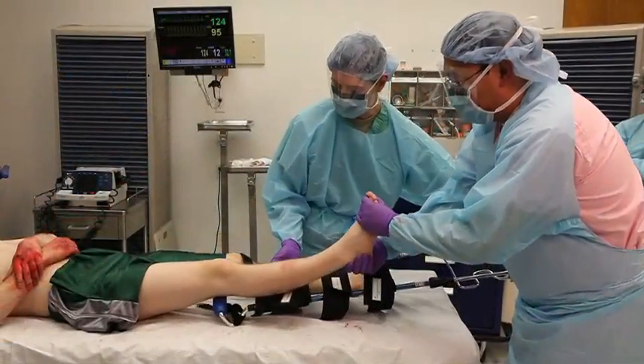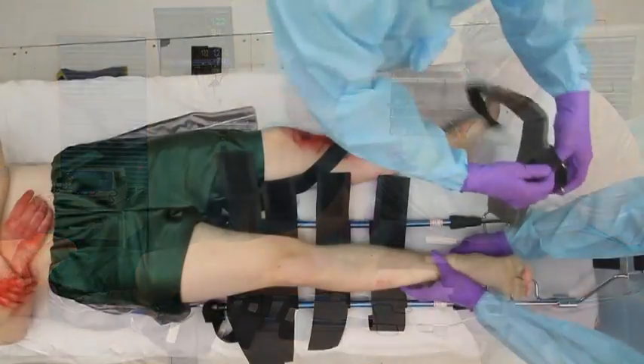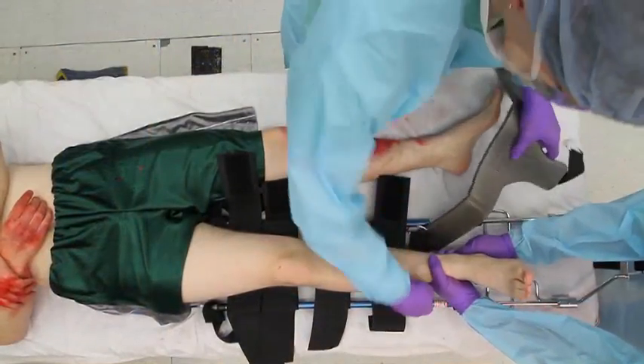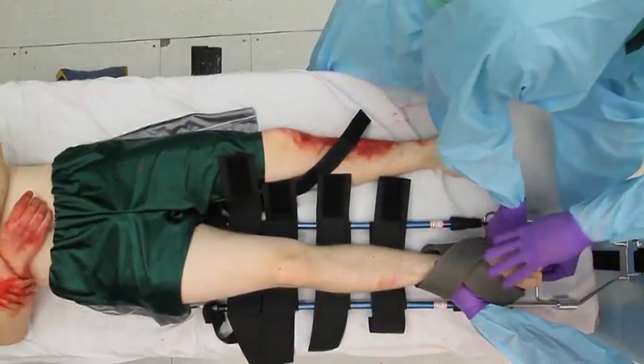The padded portion of the splint should rest against the ischial tuberosity. Position the ankle hitch around the patient's ankle and foot, while the other person maintains manual traction on the leg.